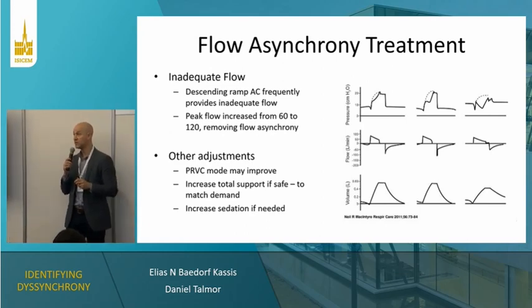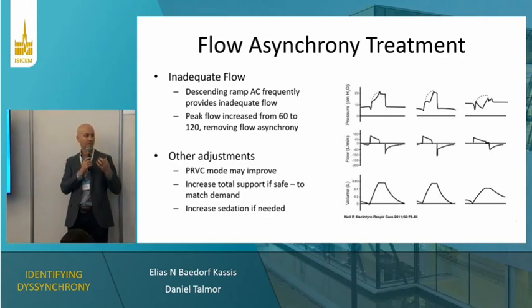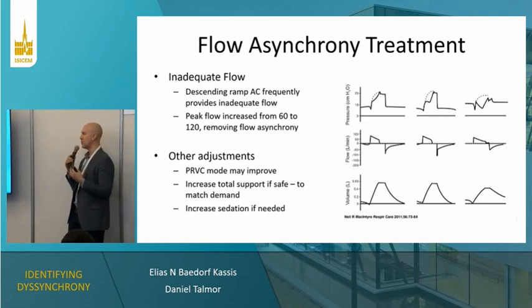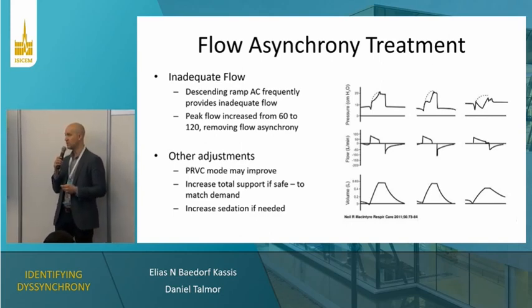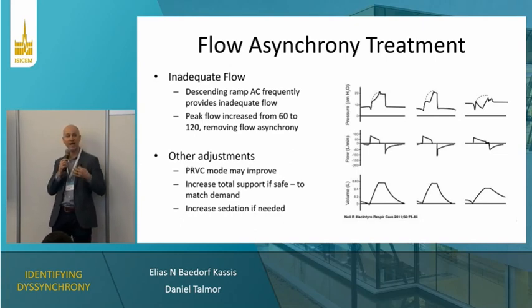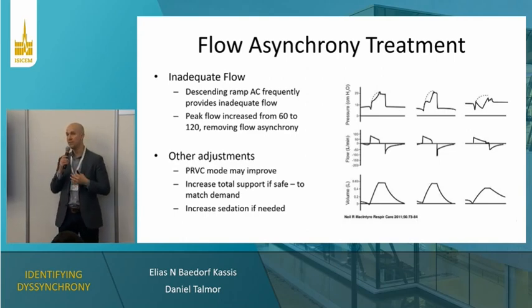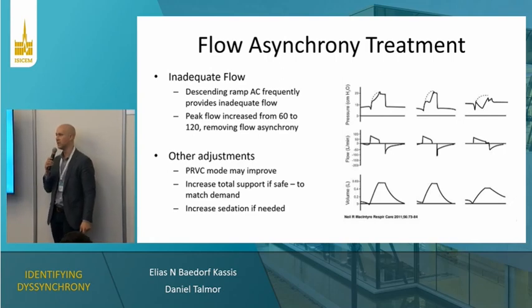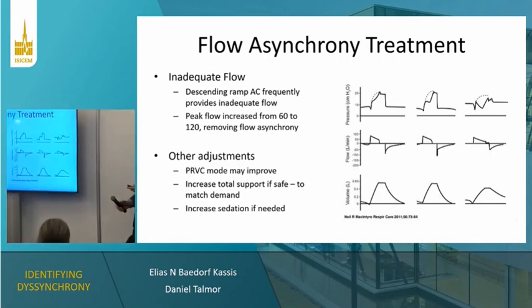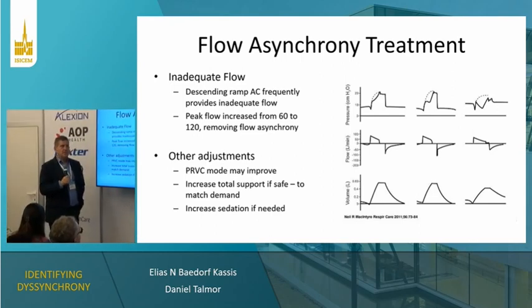The risk for flow asynchrony is not totally defined yet, but we think that most likely, if these are patients who are exhibiting really high drive, they could be injuring their own lungs through self-induced lung injury as well. So this is one of the ones that, again, we don't definitively know how injurious it is, but I get very worried about my patients when I see them with this. And in some cases, we need to actually more deeply sedate them if we're unable to approach the dyssynchrony on the ventilator itself.